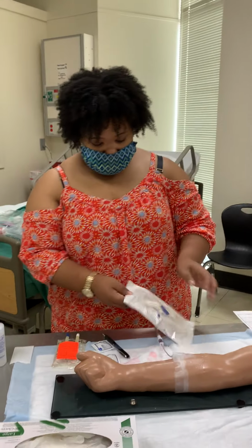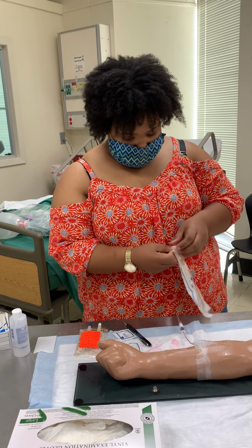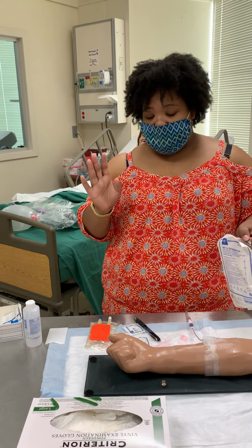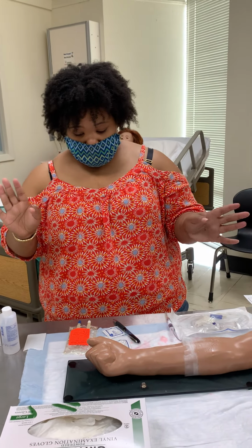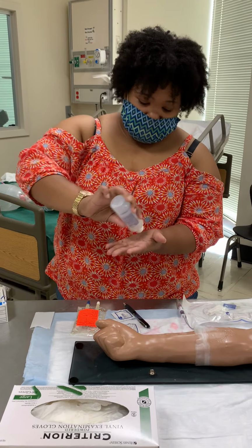Now I need to prime my tubing before I get ready and go to the room. And before I start preparing anything, I need to wash my hands. Okay.